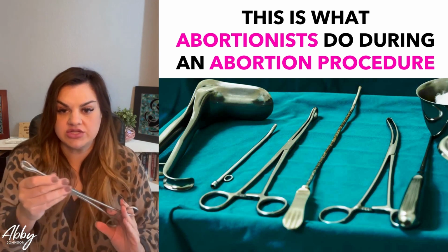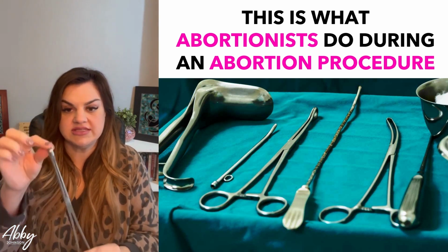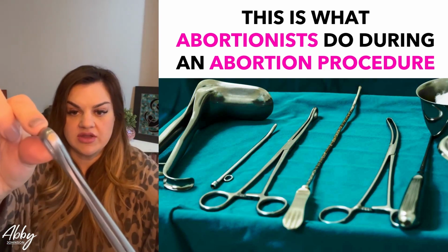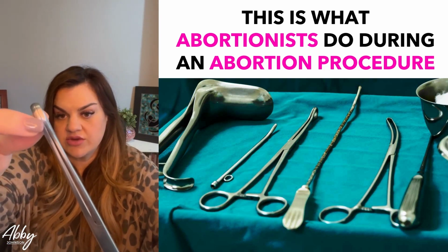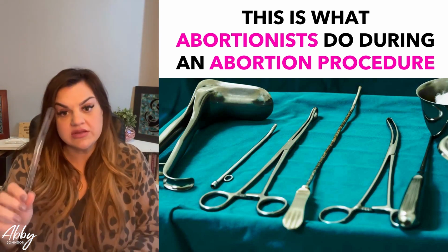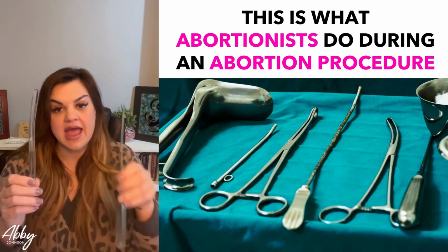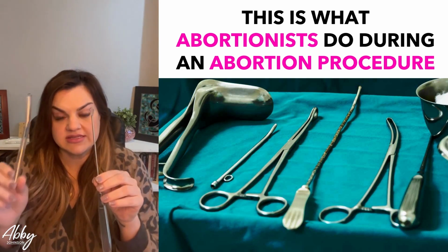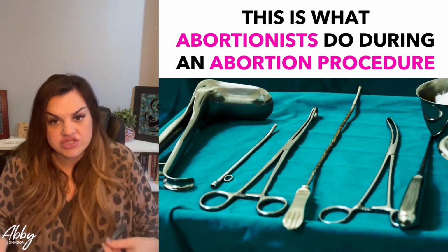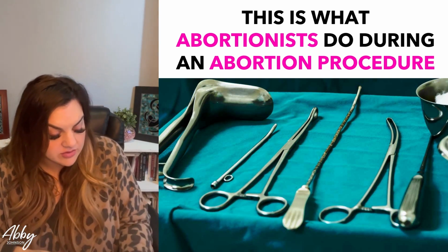And so that's why I wanted to show you what this looks like and how rigid these teeth are here on the ends. And you can even see sort of the ridges right here. And then in a second trimester abortion, after all of those pieces have been removed, they will take again these two instruments, a suction and a curette, and then scrape out and suction the remaining parts out of the woman's womb.